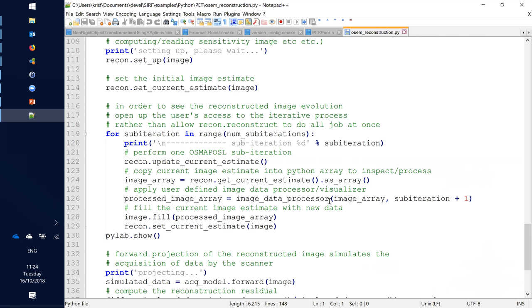So for us, it will be launching the command line. Sure, but time. Fine. Normally the data file will just stay in cache, so you don't have to read it again. Normally, there's another example here where you just say, okay, I have my reconstructor set up now. You say reconstruct, then it will do the whole thing, yes.